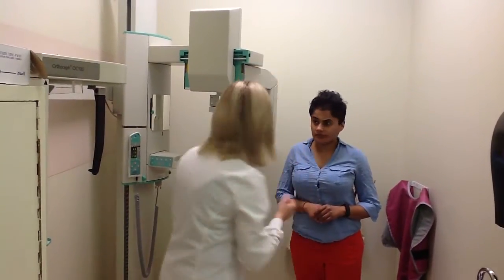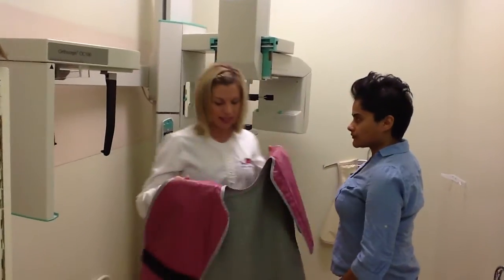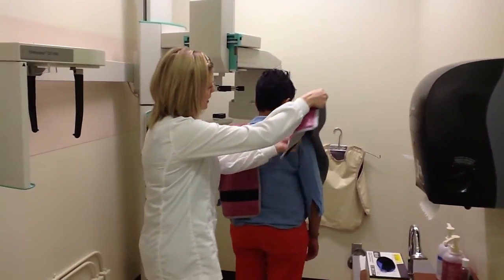So before, I'm just going to have you stand over here. I'm going to place a lead apron on you. Just be prepared, this apron is quite heavy, so brace yourself. I'm going to place it on. Is that okay? Sure. And I'm going to attach it at the back here.